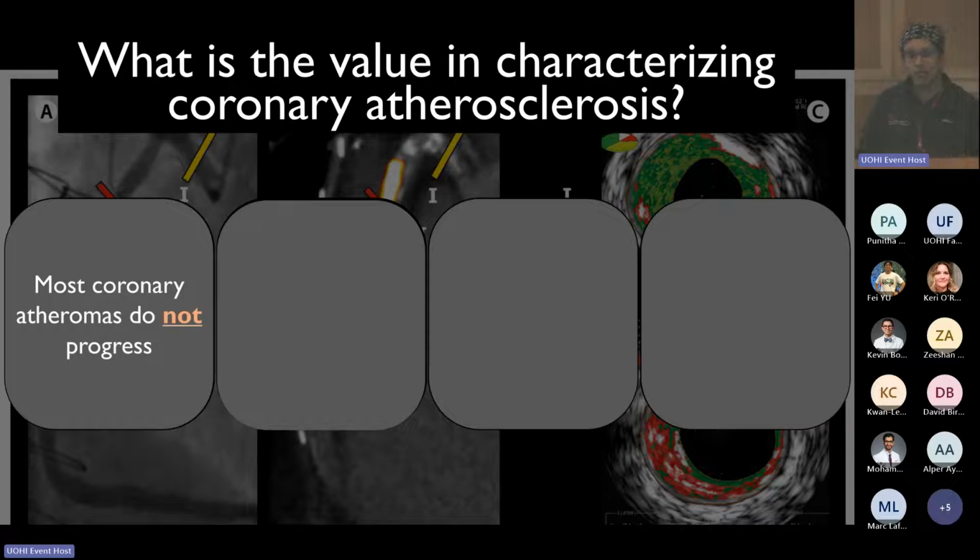So of course we can take images, angiograms, CT, and invasive imaging that can tell you how tight the narrowing is. We can absolutely do that. But we can also take pictures and try and glean from them exactly how much lipid content, calcium, etc., is in the wall of the plaque, and that may actually have a prognostic bearing on the management of the patient.